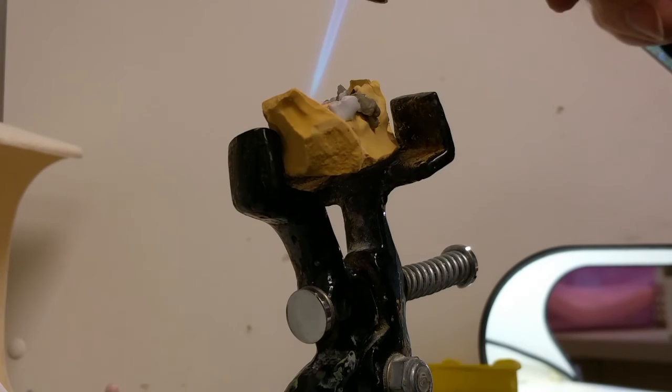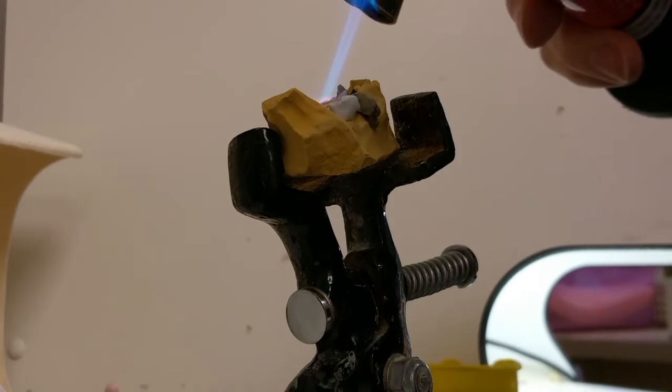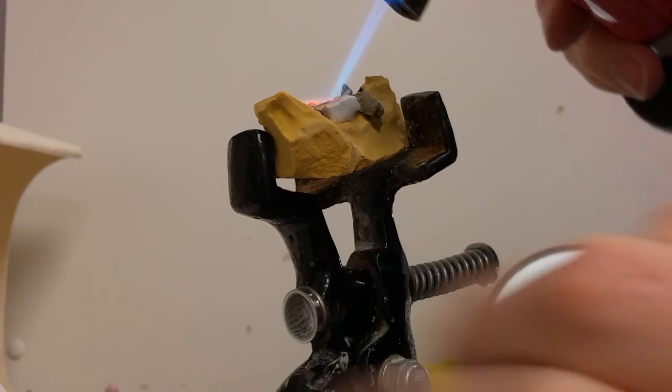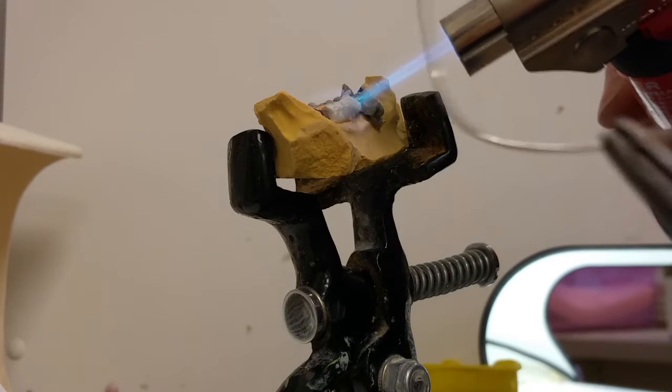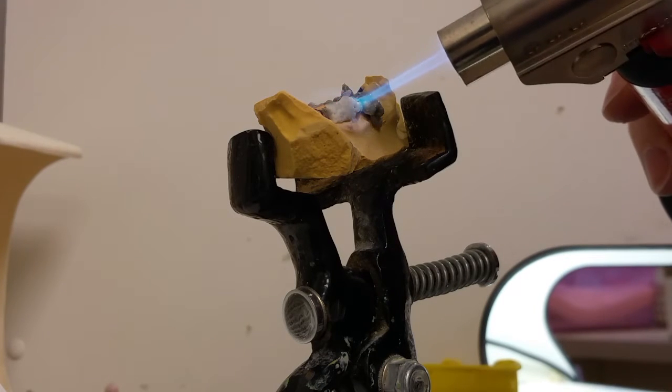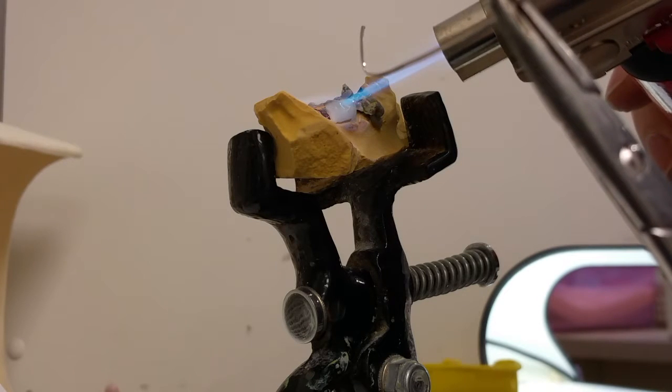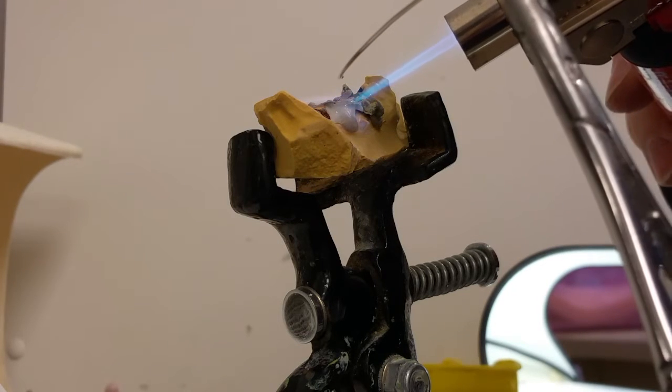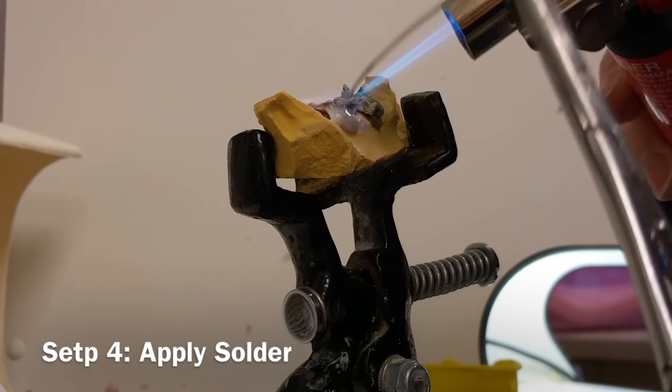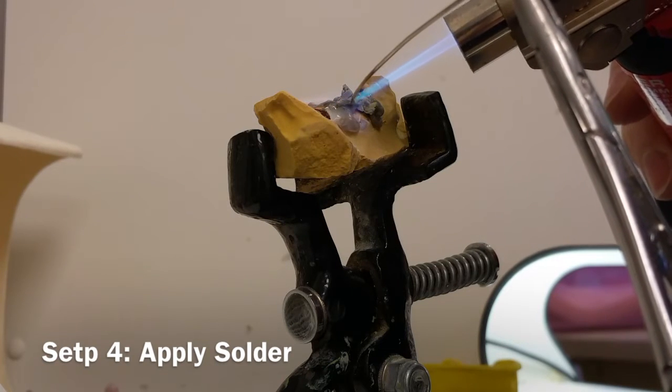The first thing I do is I heat the tooth. That softens the tooth and allows the band to come off without breaking the band or twisting the band. It helps to heat from the inside to heat the band. I'm applying heat, moving the flame tip around on top of right where I want to put the solder.